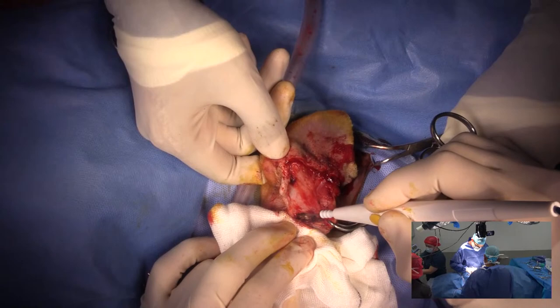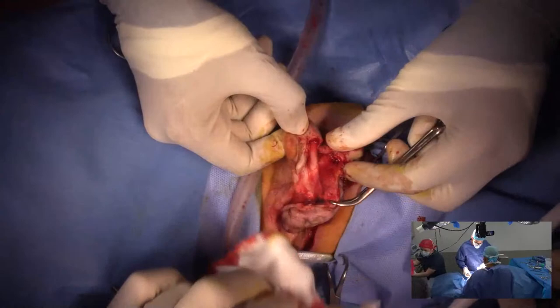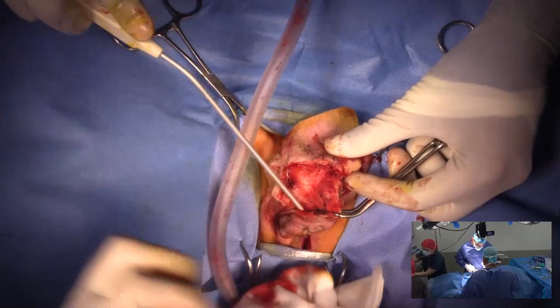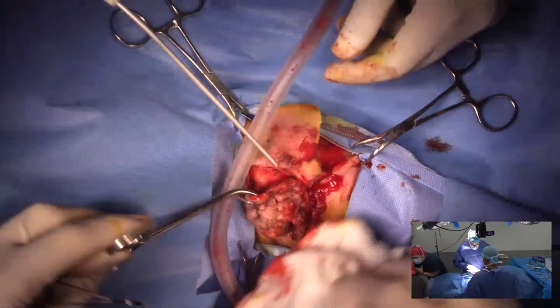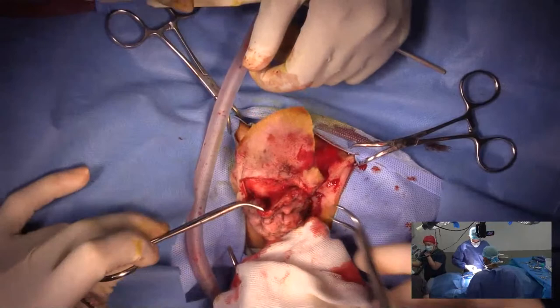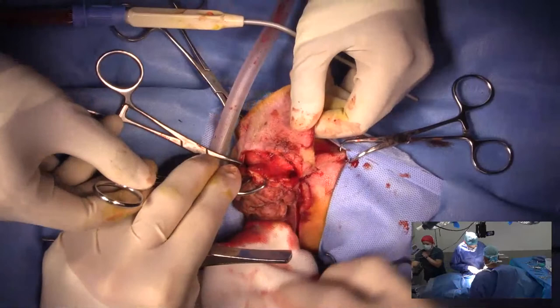And it is possible that we would get pinna necrosis here from lack of blood supply, because the blood vessels run rostrally and caudally. But we've got a third one that runs in the middle, so hopefully that will be enough to maintain blood supply. All right, so let's get another towel clamp here. So just retract on that. Can I get cautery turned down to 20, please?